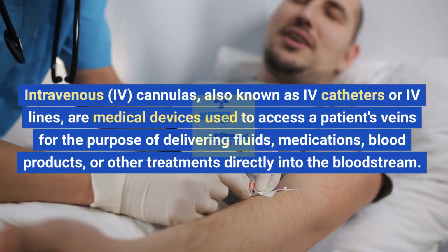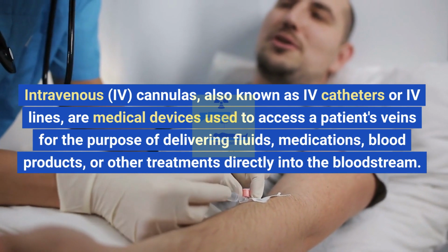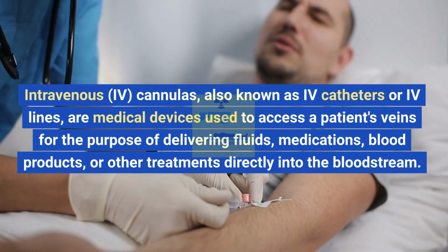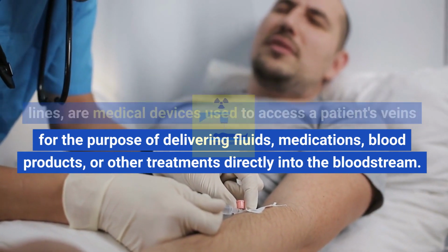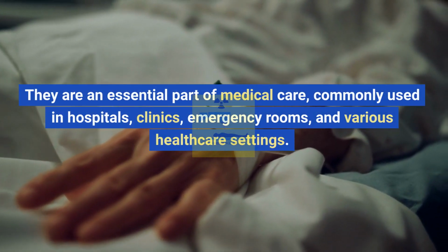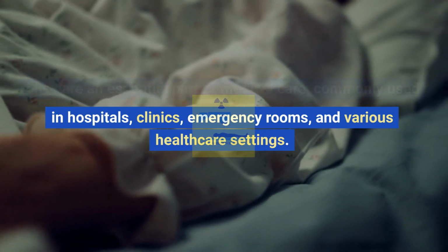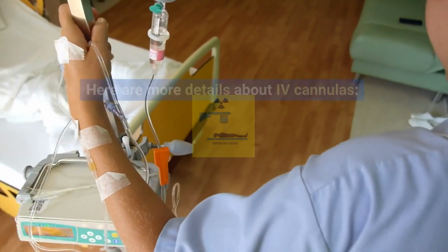Intravenous (IV) cannulas, also known as IV catheters or IV lines, are medical devices used to access a patient's veins for the purpose of delivering fluids, medications, blood products, or other treatments directly into the bloodstream. They are an essential part of medical care, commonly used in hospitals, clinics, emergency rooms, and various healthcare settings. Here are more details about IV cannulas.